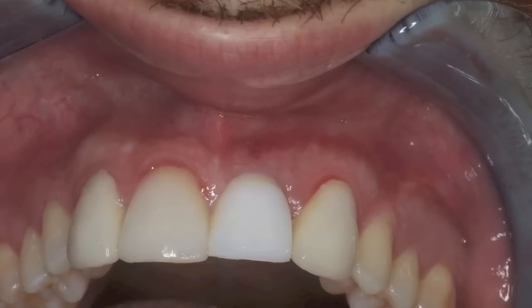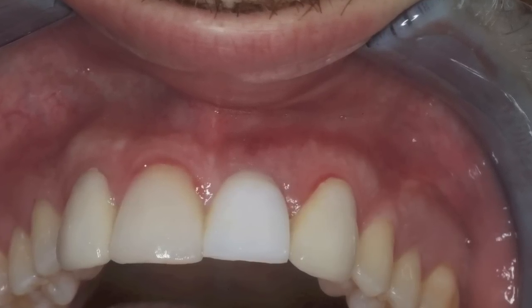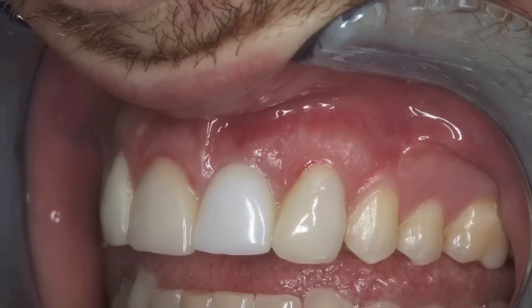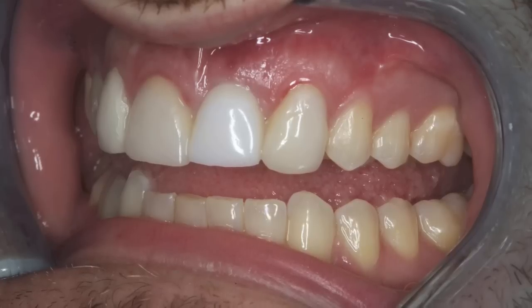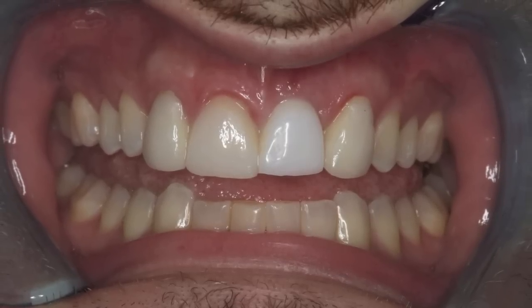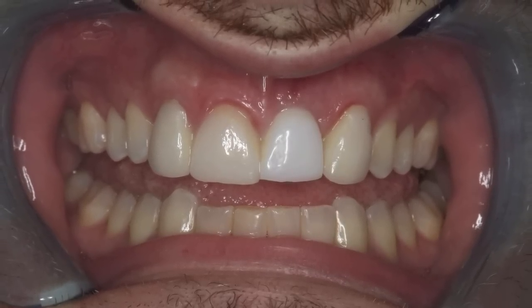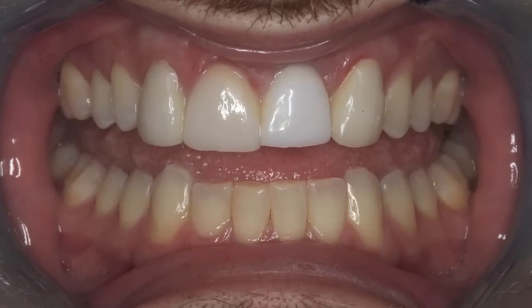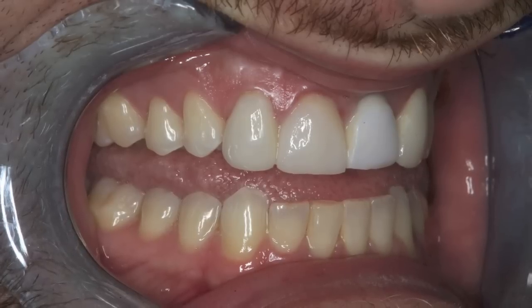This is a week later. It actually looks pretty good, and I was very hopeful that just taking the implant crown off, getting everything cleaned up, and putting on an antibiotic, that the implant would still be in great shape. Really, as we evaluate it with the rest of the video, you'll see that when we press on the gum tissue, that there is pus coming out.